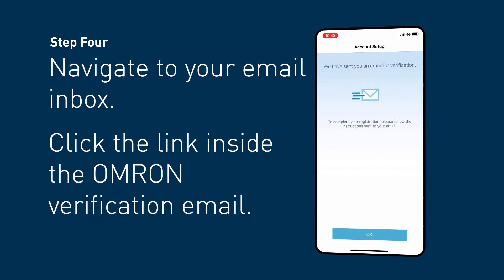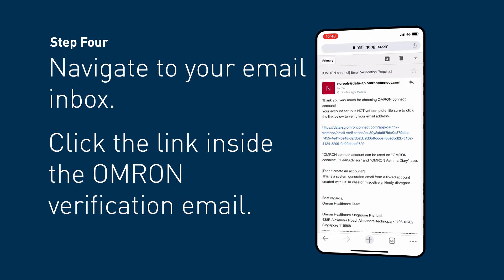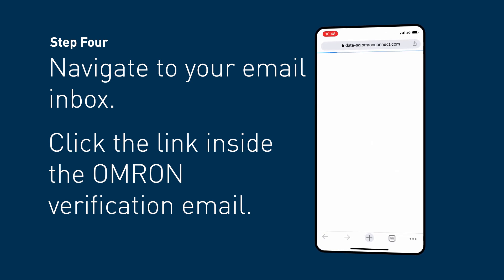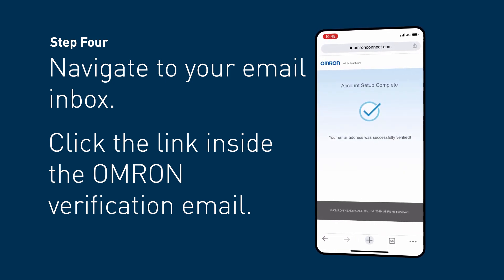Select the Create an account button. Once your account has been created, you will receive a verification email. Please make sure you verify your email by clicking the link, as this is an important step to ensure you have access to your account. Please check your junk or spam folder if you do not receive the email within 2 minutes.